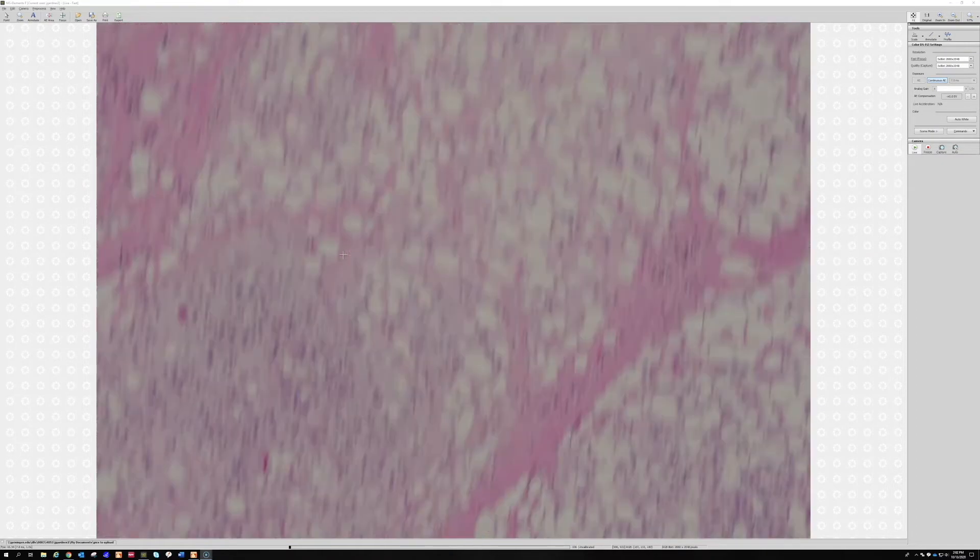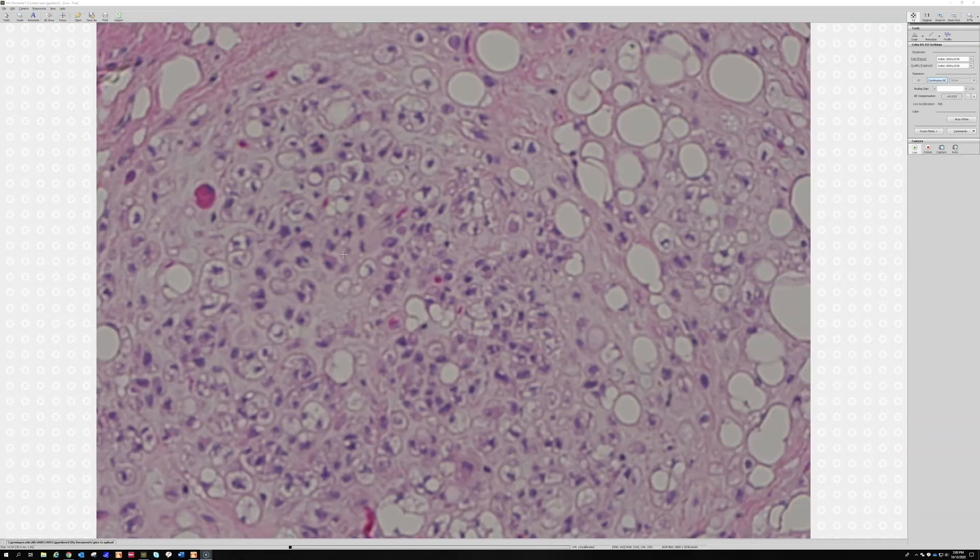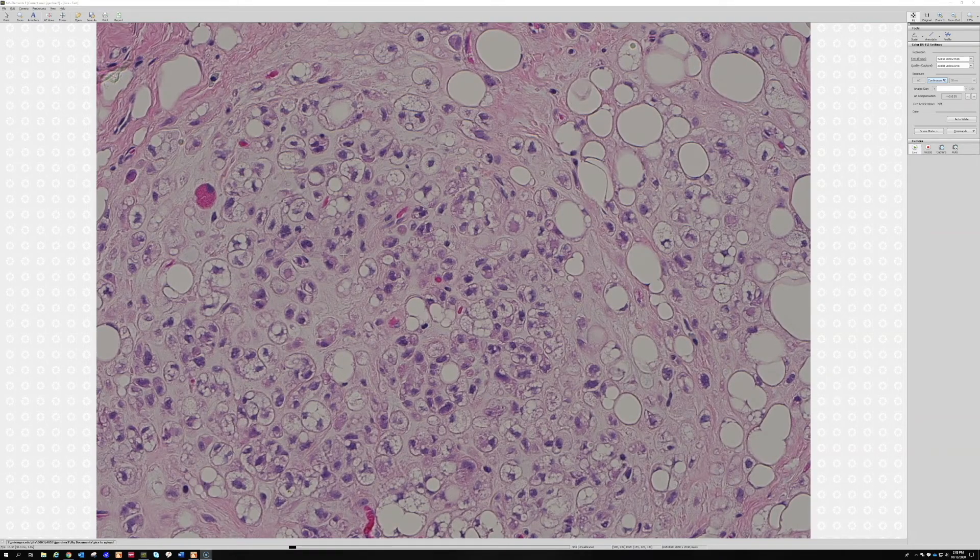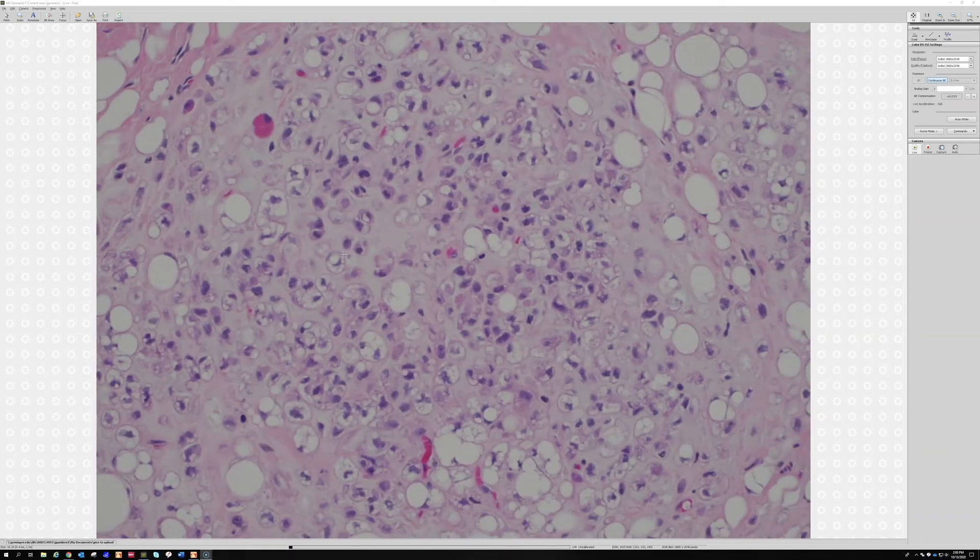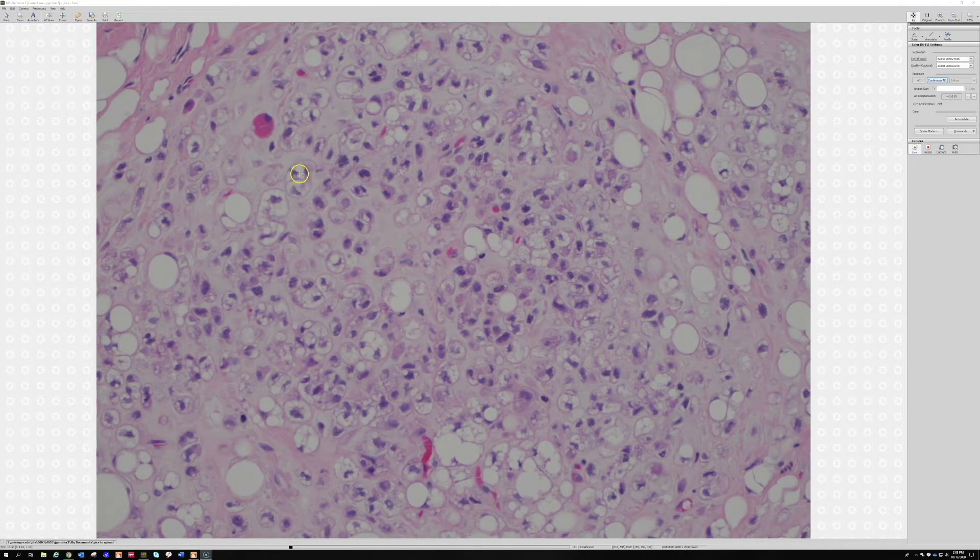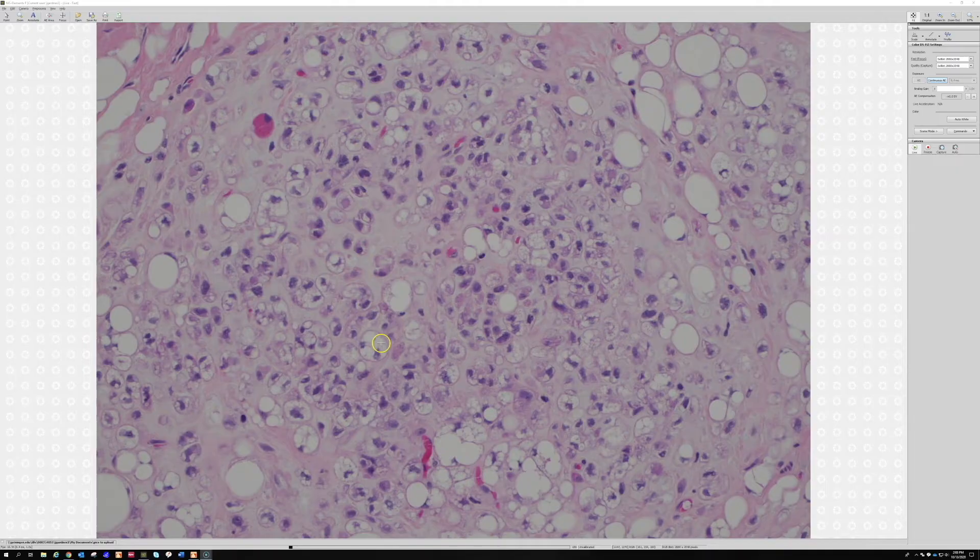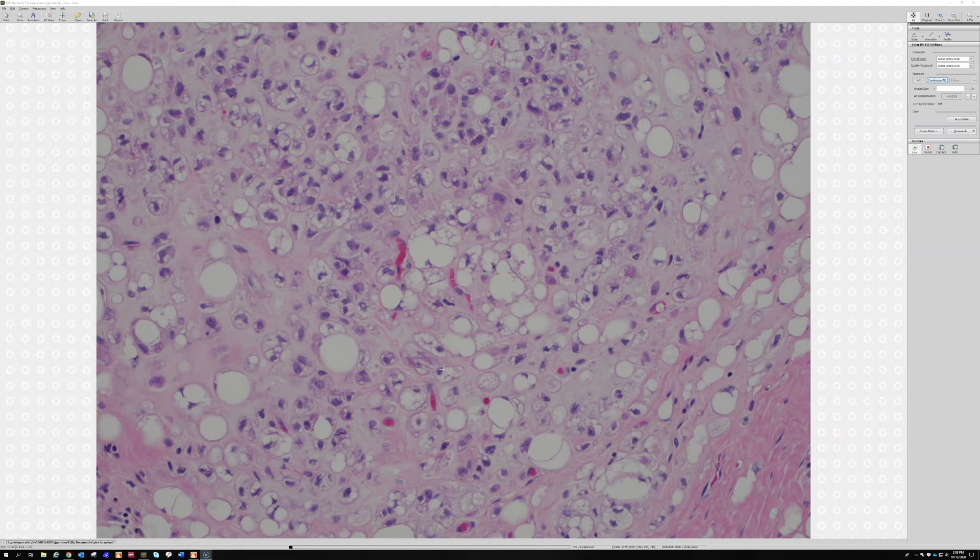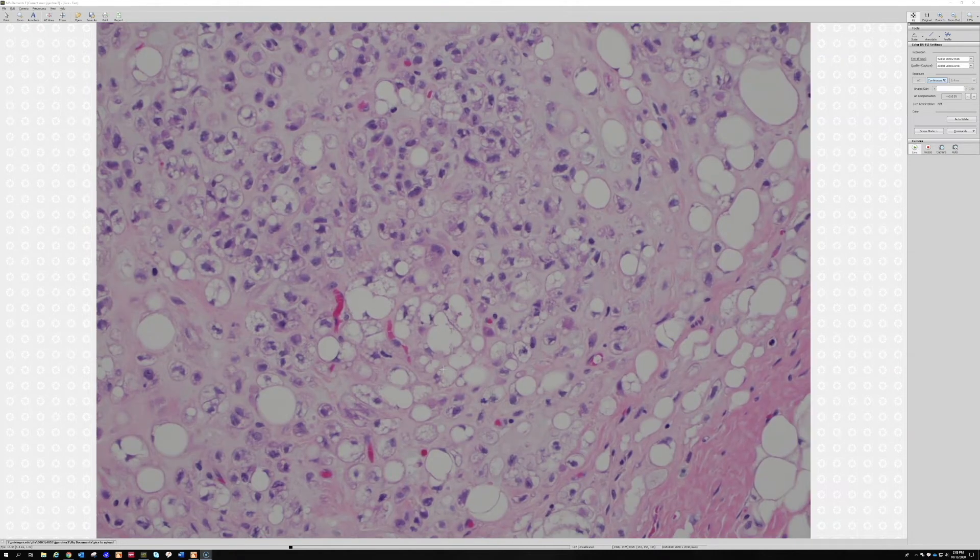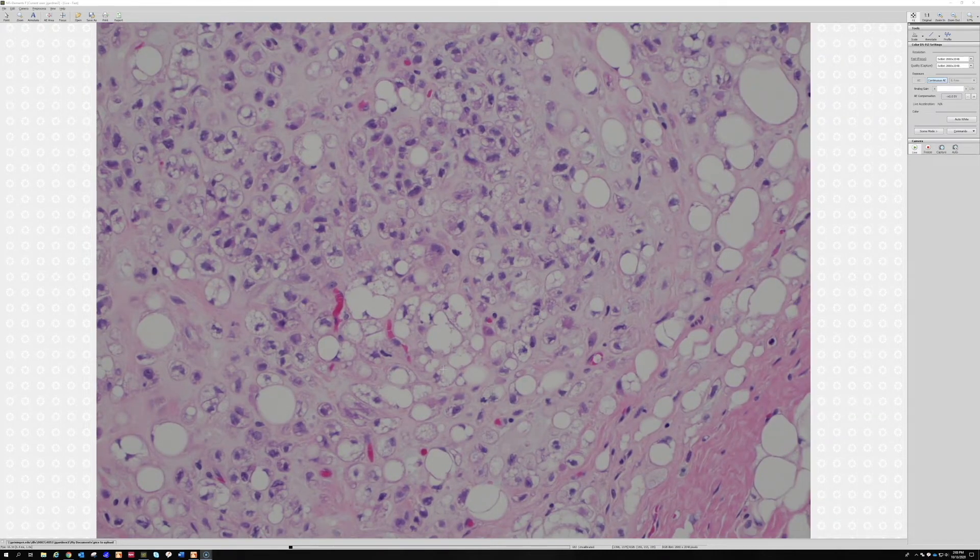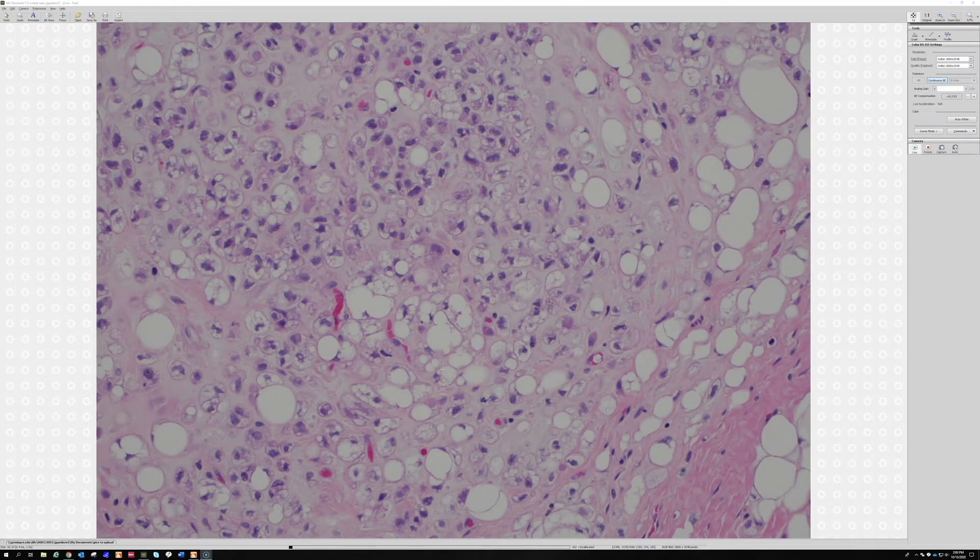The last thing we see, in addition to these cells sitting in the chondromyxoid background—what about these guys? What would you call a cell like that with lipid bubbles that are totally clear, indenting the nucleus? I was calling those lipoblasts. I mean, they've got to be lipoblasts, right? Whatever name anyone wants to call them, to me that's a lipoblast—true lipid vacuoles in a mesenchymal cell. The only thing that really looks like that outside of lipoblasts is like a sebaceous cell, sebocytes, but these are not epithelial cells, so it can't be that.